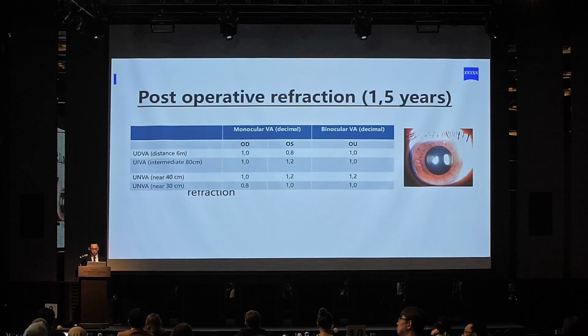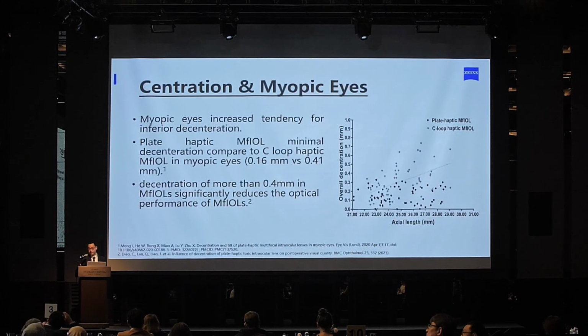For the post-op refraction, after 1.5 years, the visual acuity is still excellent. What I want to highlight with the 2 cases is, first, I use a plate haptic IOL and then an additional CTR for the case. What I'm concerned about first is the centration.